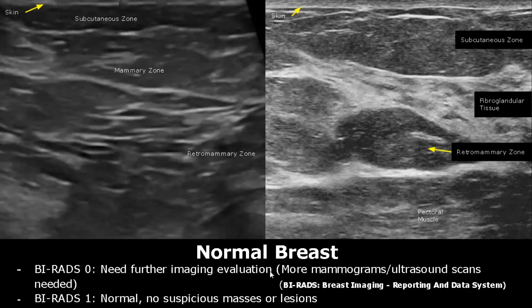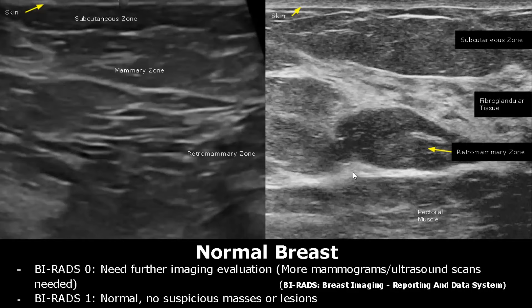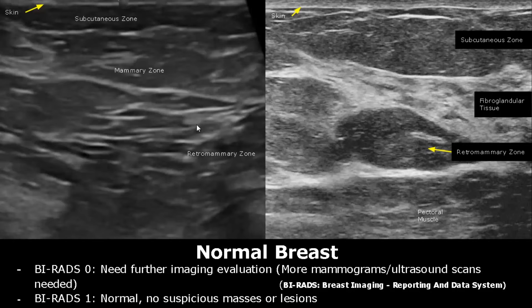Breast pathologies can be classified using a system known as BI-RADS, which stands for Breast Imaging Reporting and Data System. In total it has seven categories. In BI-RADS 0, we need further images — more scans such as mammograms or ultrasound scans. BI-RADS 1 is for normal breast tissue where there is no mass, no distortion, and no lesion. Both these images are BI-RADS 1.